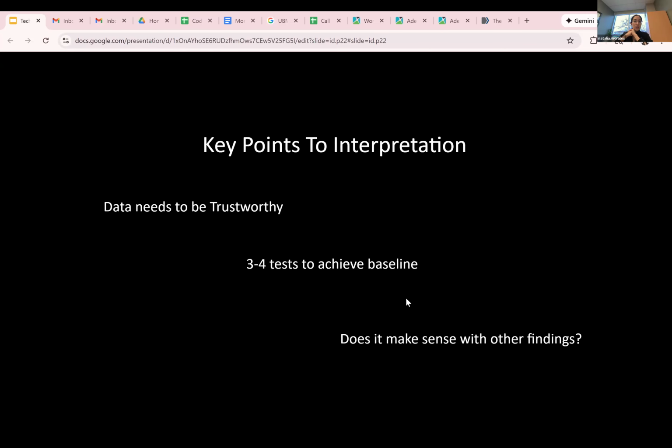So, someone who has 0.2 nerves that look healthy, have no pallor, their OCT looks full, and they're testing 20/20, but really did poorly on a visual field, that doesn't make a lot of sense to us. There's nothing that indicates that their visual field should be that poor compared to everything else that we're seeing. So you have to put visual fields in the context of the clinical picture to make sure, yes, this does make sense.